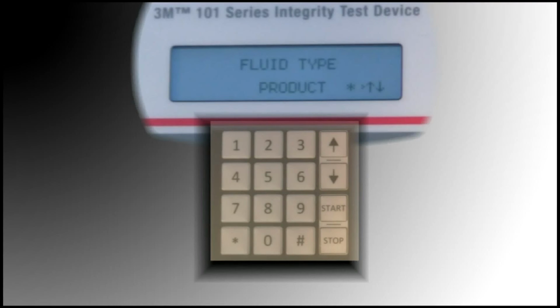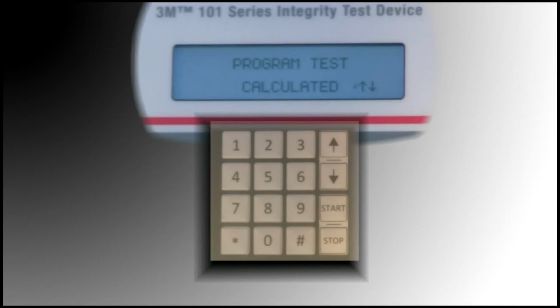Note that these are the only choices available. Also, entry on the screen is not mandatory to conduct a test. It is a purely optional entry for informational purposes only. Press the up arrow on the device to complete the programming phase.